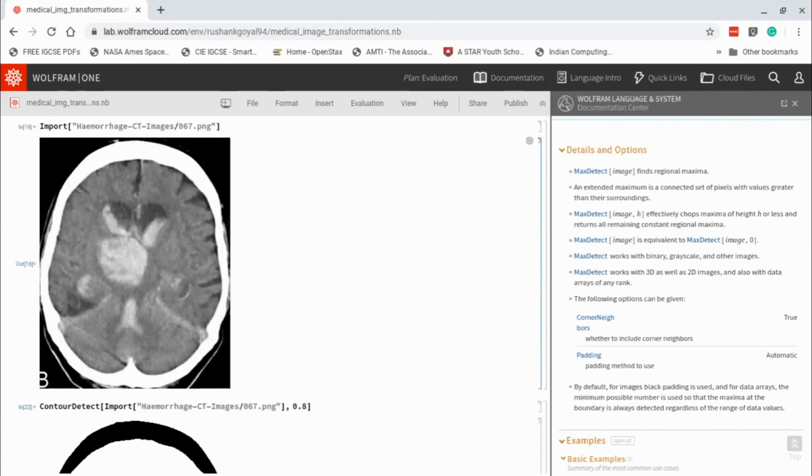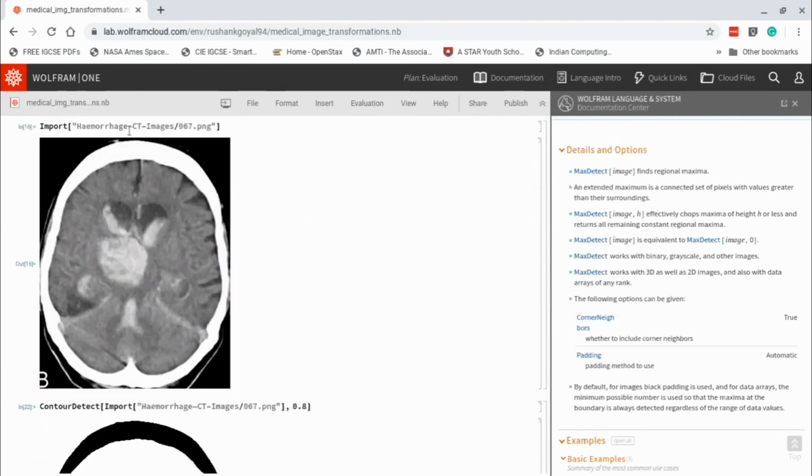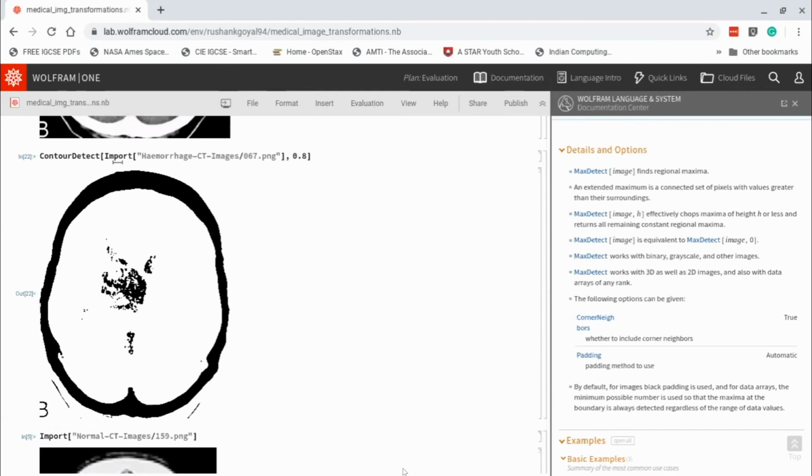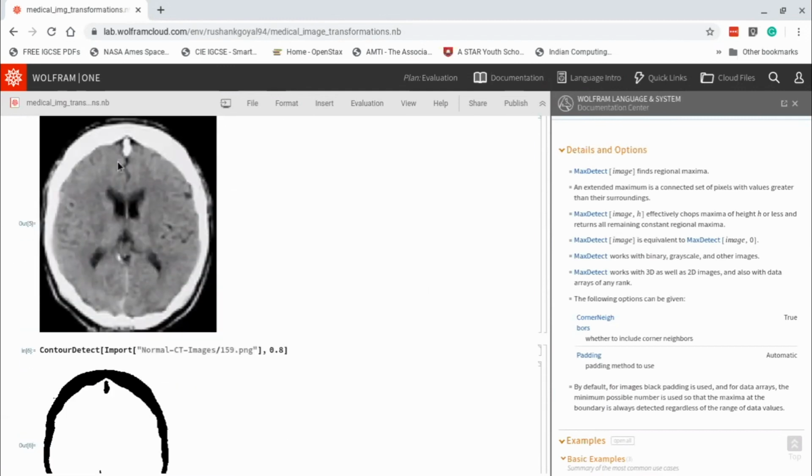You put in an image and it tells you if the person has a hemorrhage in their brain. So it's an AI tool to reduce doctors' workload. That's also why I put this in my examples, because if I apply the transformation I showed you, it's going to make it really easy for the algorithm and give much better accuracy.